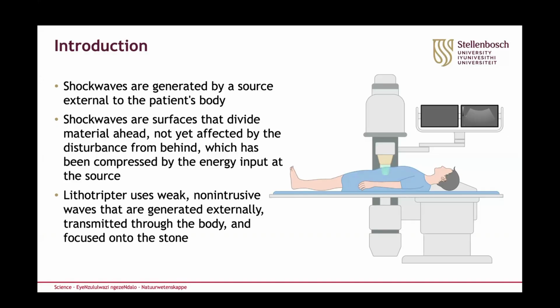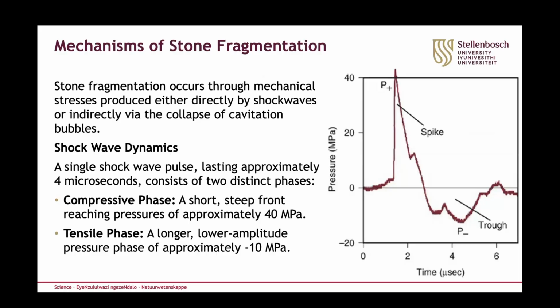Lithotripters use a weak, non-intrusive wave that is generated externally, transmitted through the patient's body and then focused onto the stone. Looking at the mechanisms of fragmentation, stone fragmentation occurs through mechanical stress produced either directly by the shockwaves or indirectly by the collapse of the cavitational bubbles.